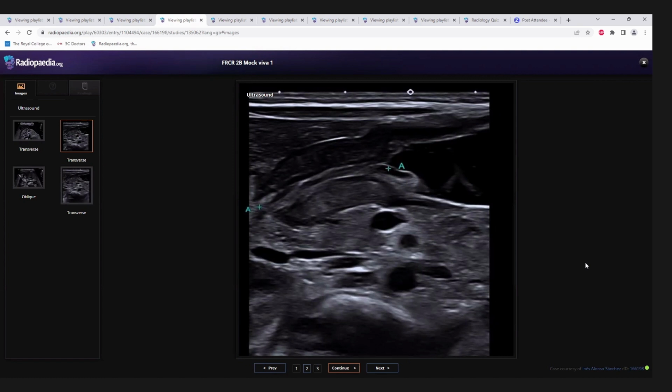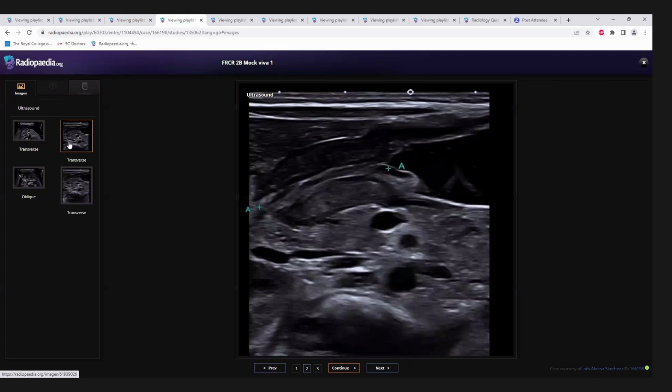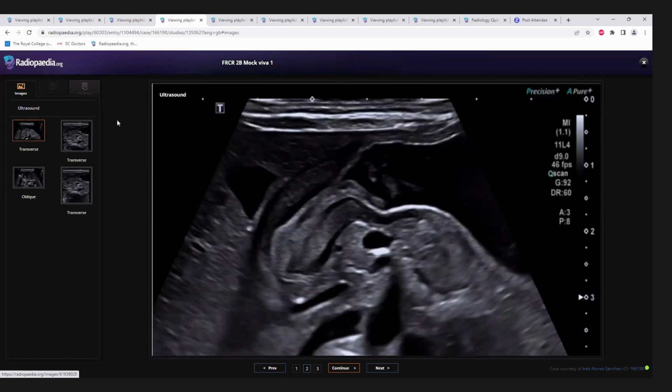This is, I think, the neck also, or if there is any history. Now, in exams, they are not giving you the region. They will not mention the region. Okay.